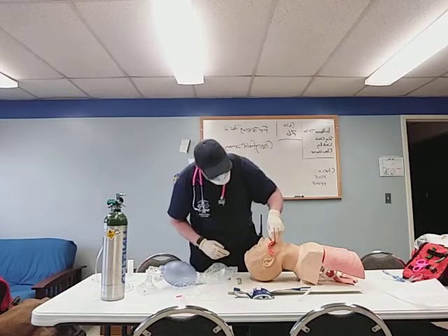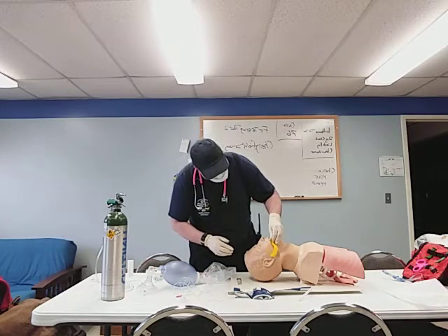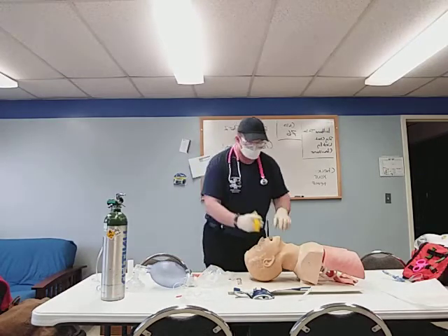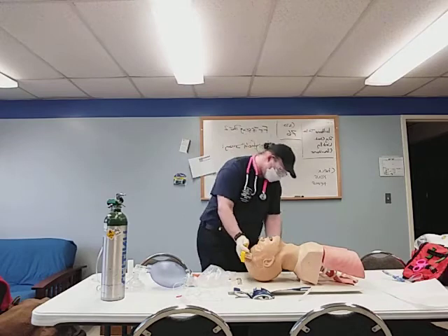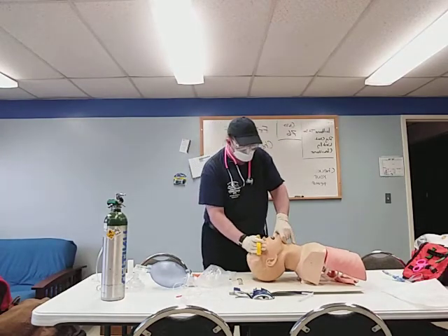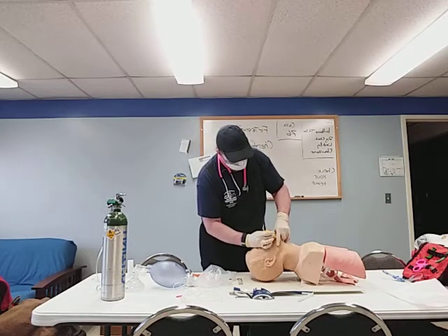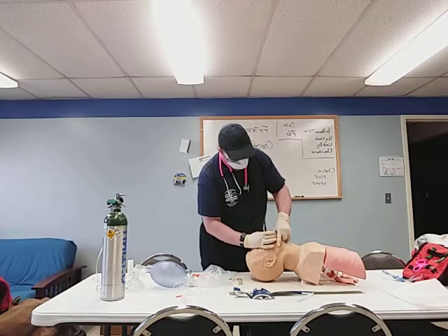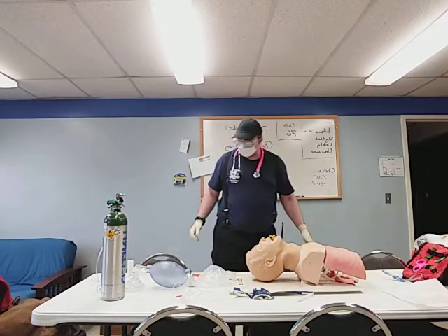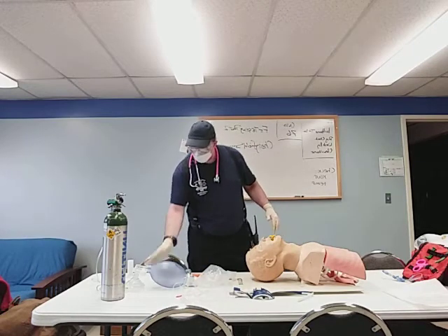Measure my OPA. I have 30 seconds to do this, and there's no time like the present. I'm going to make sure the head is in the right position with a chin lift, and I'll pull the tongue and jaw up with a jaw lift, chin, tongue lift maneuver, and begin.